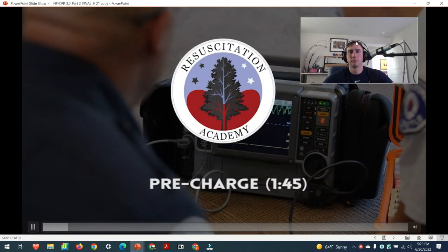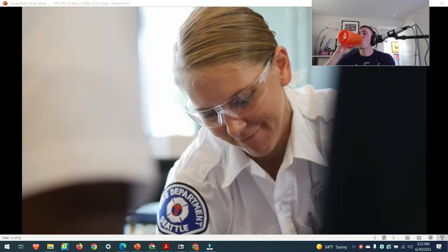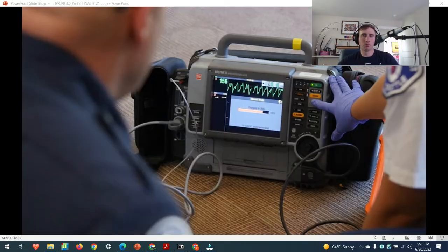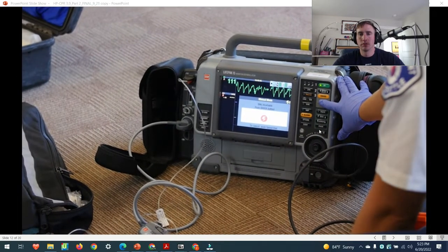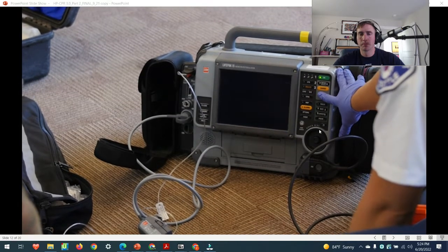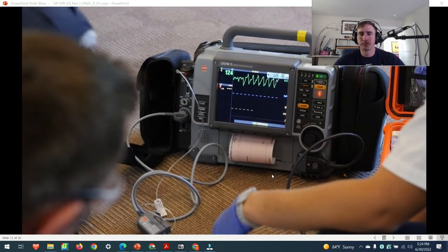Pulse to CPR. 15 seconds left in the cycle. Okay, I'm gonna pre-charge. 10 seconds. 10, 5, 4, 3, 2, 1. Hold CPR. That looks like, yeah, we're gonna shock it. Continue CPR. 8, 9, 10.